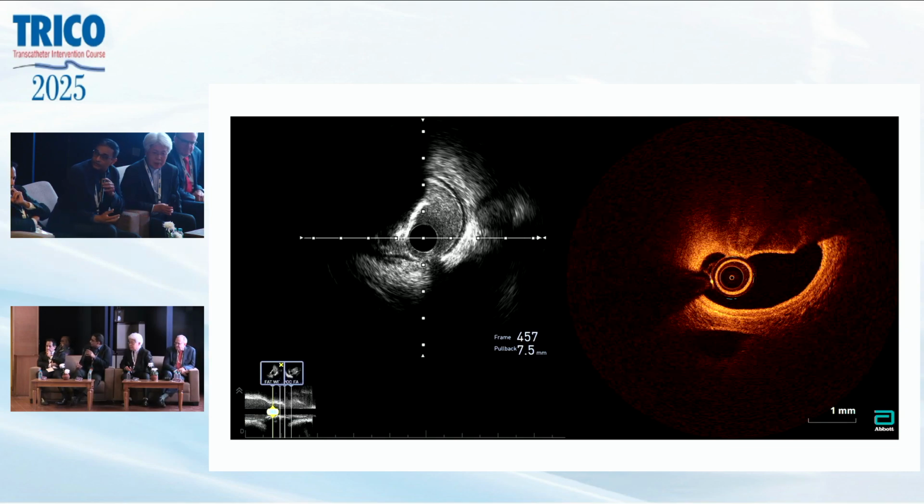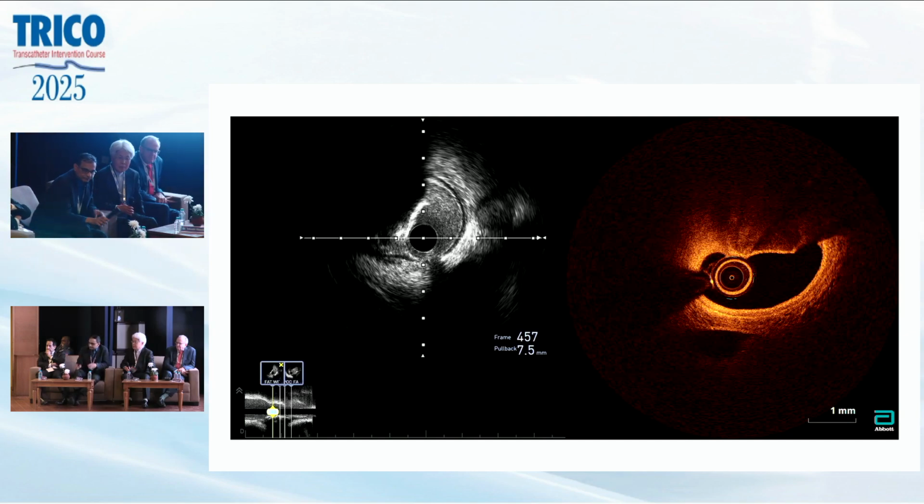Okay. We also have multi-axial rota and a low-speed run, which we do at the end, and that is what helped us to get the best. But it is always difficult to manage. Dr. Akasaka?